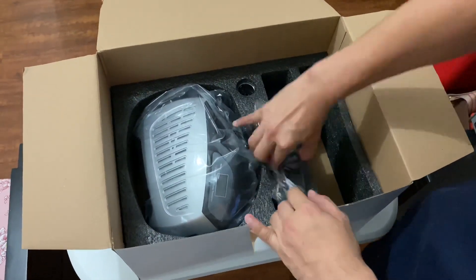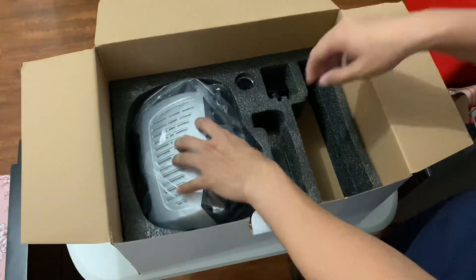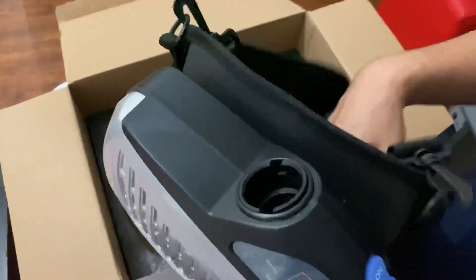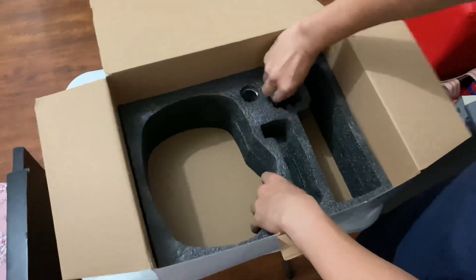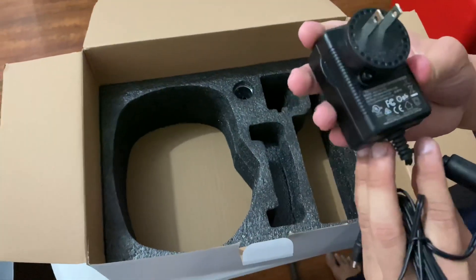And then, the battery for the respirator unit. The respirator unit with the belt. It has a harness also.